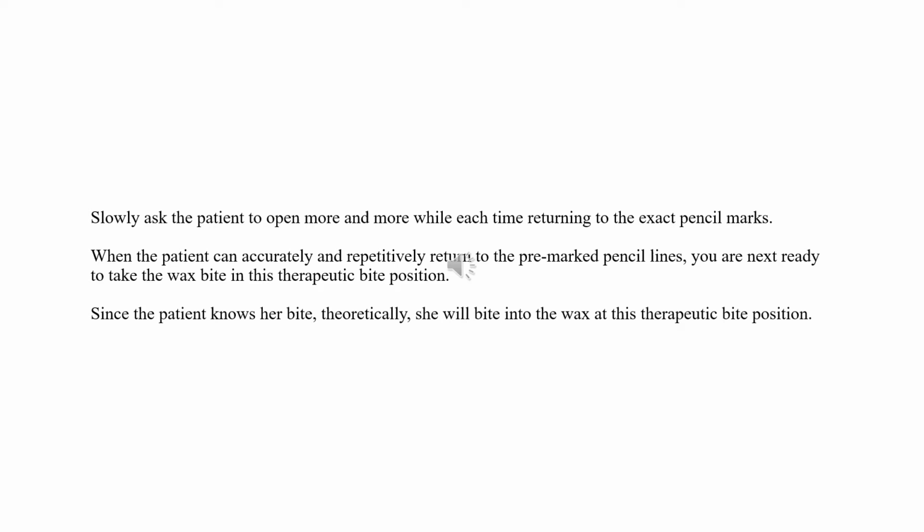So during this whole coaching process, very slowly and with the patient looking at the mirror, slowly ask the patient to open more and more. So tap, tap a little bit. Okay, great, she's got it. Open a little bit more. Tap, tap. Great, she's got it. Open a little bit more. Oh, wait, she can't get it. Let's go back to the previous one. Tap, tap, she's got it. Now open a little bit more. Tap, tap, she's getting it.